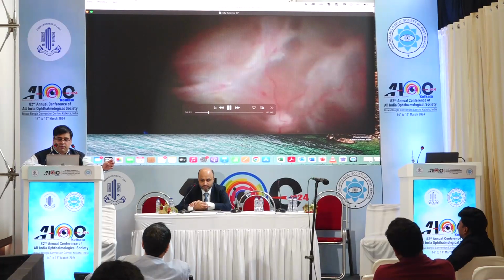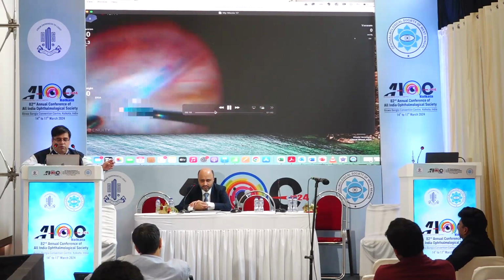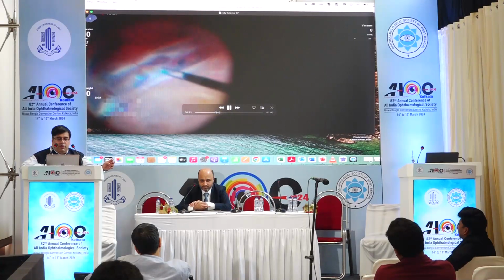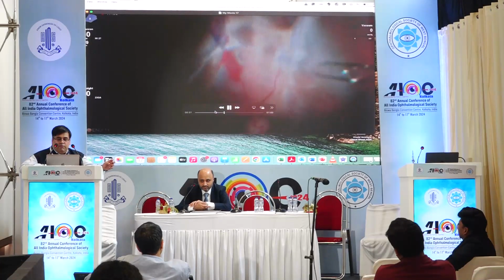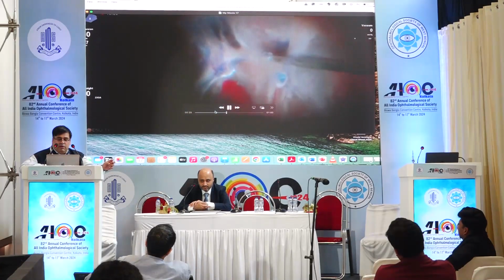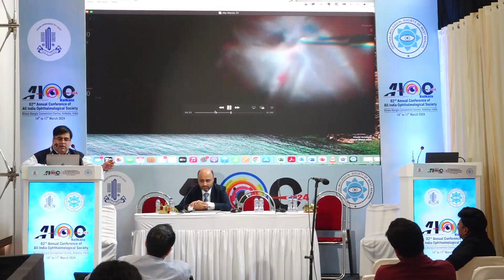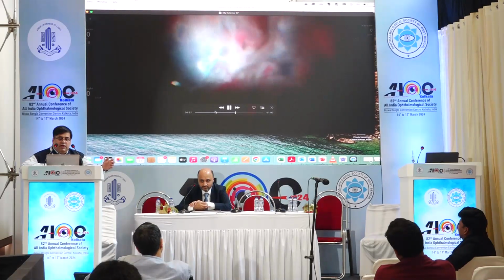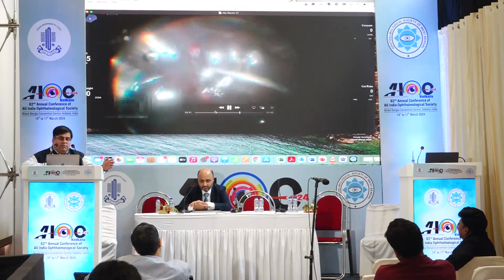There was inferior PVR, inferior membranes. Yeah, so we stained it with brilliant blue, got to the plane wherein I used the brilliant blue to help me identify this membrane, and then you start peeling it from the center to the periphery, and there are large breaks which have happened. As you're doing it, the breaks tend to enlarge, but herein I was more concerned about getting each and every tissue out, because it's something important for us.